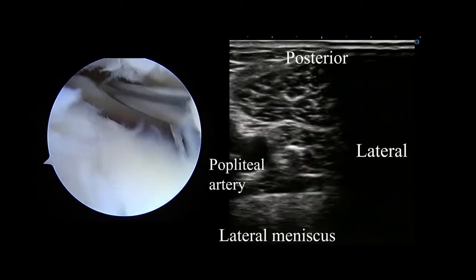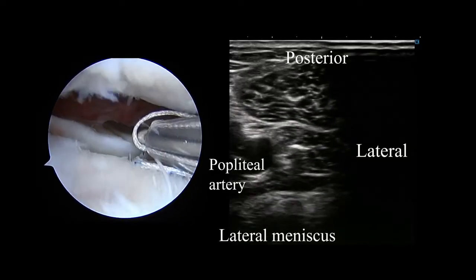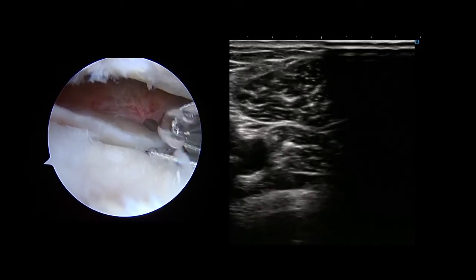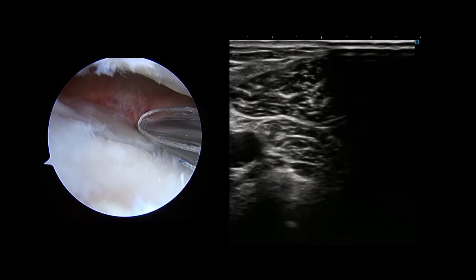The posterior LM is repaired under the guidance of ultrasound by having the assistant surgeon place the ultrasound probe, covered with a sterile sleeve, horizontally on the popliteal fossa to allow confirmation of the posterior portion of the LM and the popliteal artery.